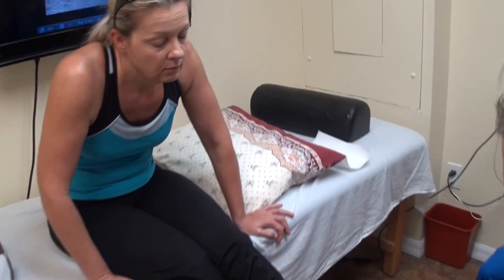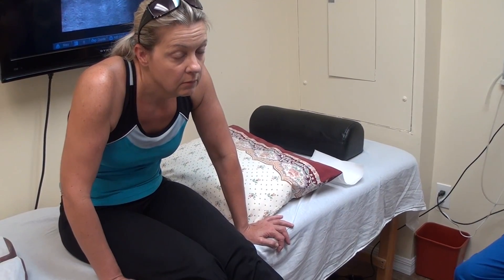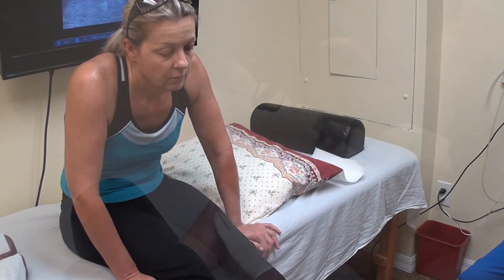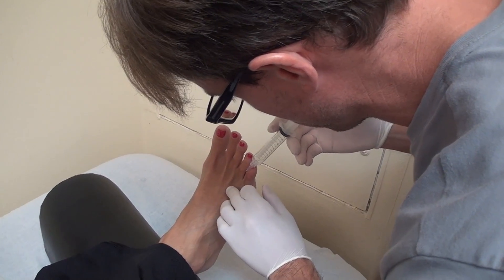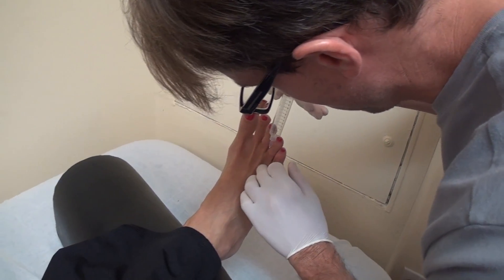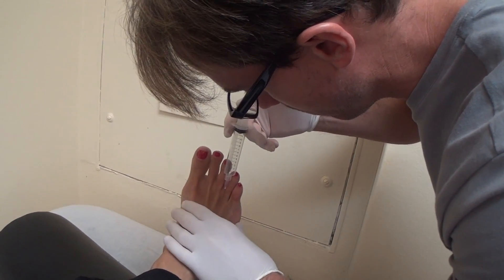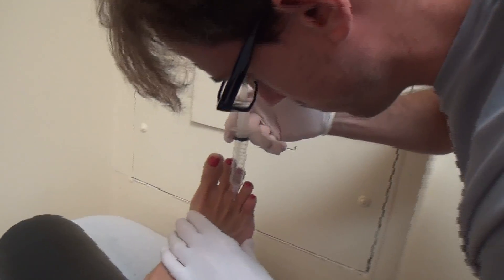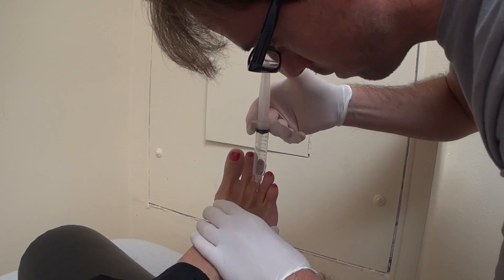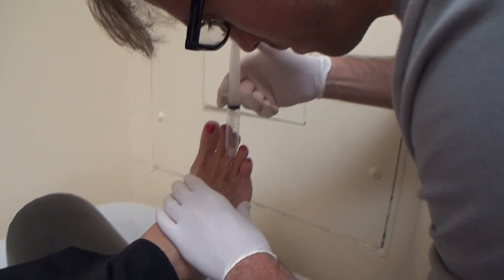What we're going to do today is follow up that procedure with some ozone treatments, looking to further heal up that area. At Gecko Joint and Spine, we often do ozone injections. Ozone gas is three oxygen molecules, and when it's injected into tissues it has a profound healing effect, stimulating regeneration and adding energy to the tissues so that they can heal. Here you can see Dr. Smithers injecting the ozone gas into the foot.